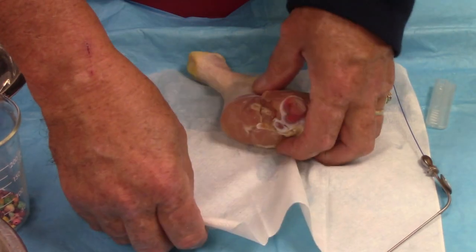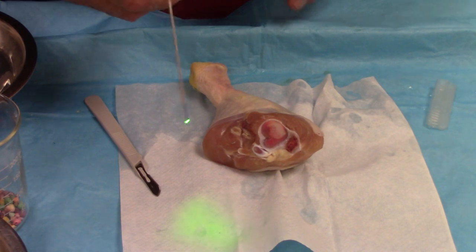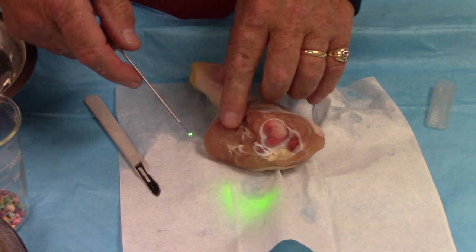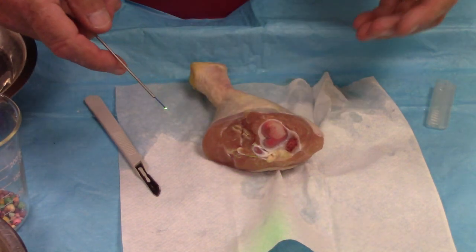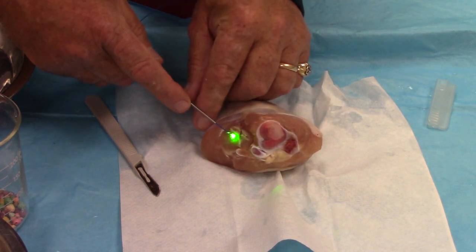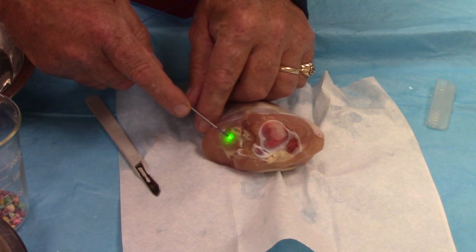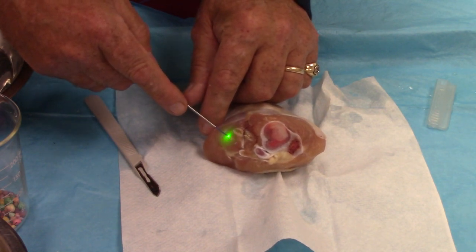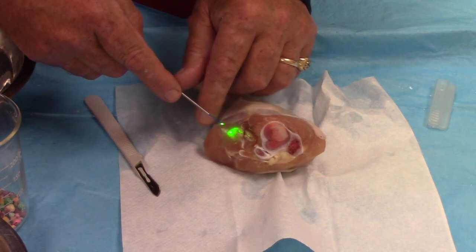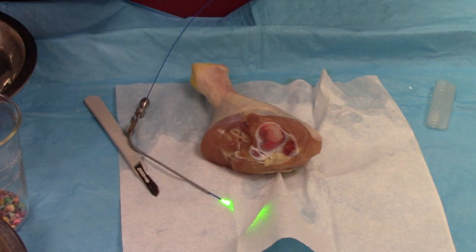Now let's do the same thing at a lower setting. This time we turned our energy down to 600 millijoules or six tenths of a joule and took the rate up to 10 times per second. This is more of what you would be doing in soft tissue, so let's put it down beside the previous area, do this again, and then compare the two.